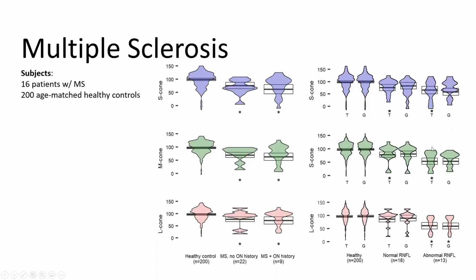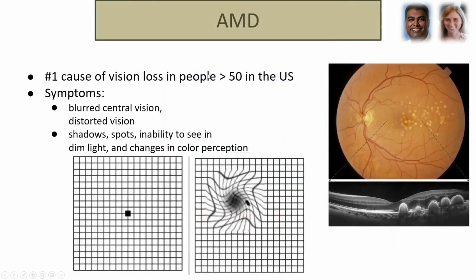Of course, we expect that if there's thinning in the temporal part of the optic nerve, there's going to be a significant reduction in color vision. So the long and the short of it is that we have a quantitative test that can provide very specific sensitivities for an individual patient. And as we would hope and expect, it works in people with multiple sclerosis. These are the people who are being tested routinely anyways for the color vision.